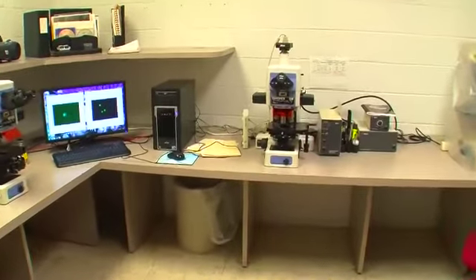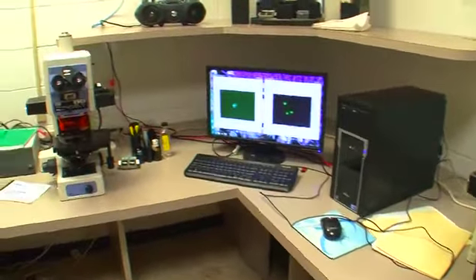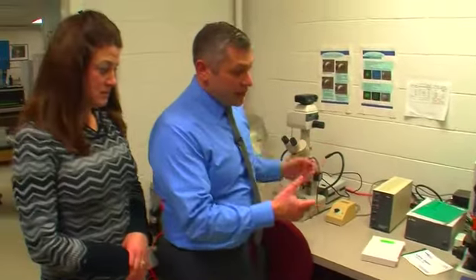Jill, the final step of this process, once the organisms are spotted on the slides and stained, they're brought in here and read by a certified technician, and that would be either Paul or myself or Donna. And what we have on the screen here are stained Giardia on the left and Cryptosporidium on the right, and these would be what may be in a raw water sample.